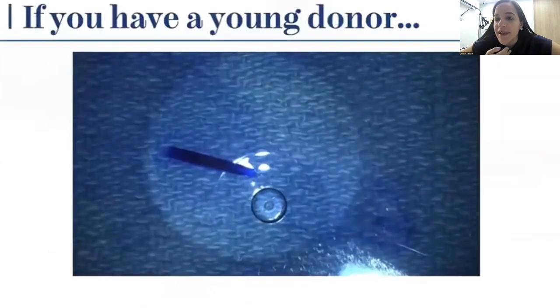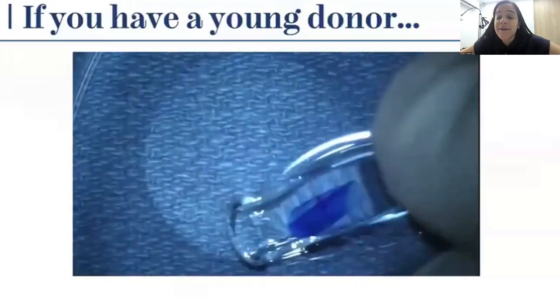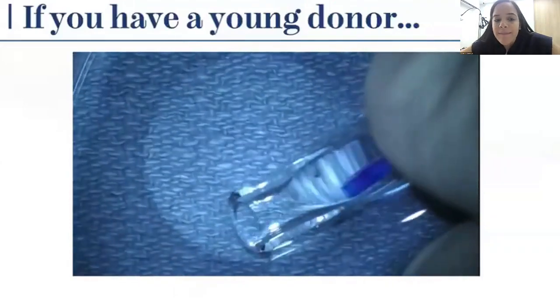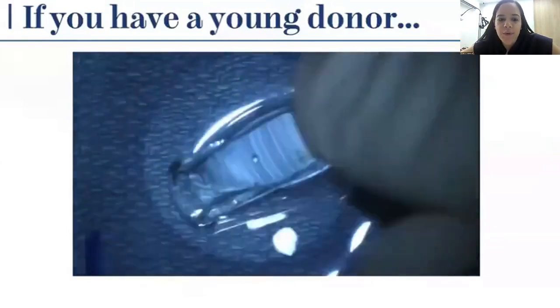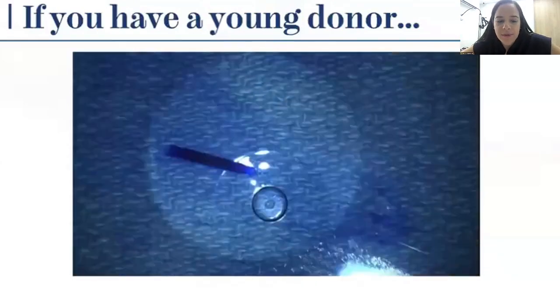But what happens if you have a young donor graft? The best way is to prepare your graft as a double scroll. So you will play with the fluid until you get the double scroll. That way, when you insert it in the eye, it's easier to unscroll. As you can see now, we have our double scroll.